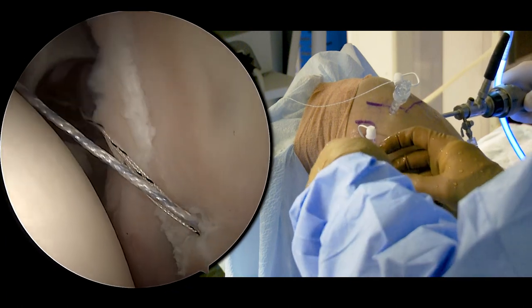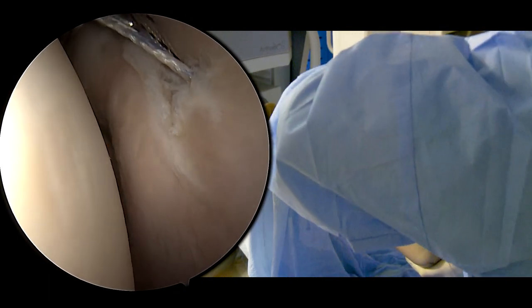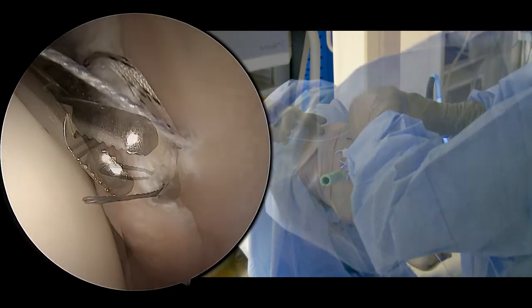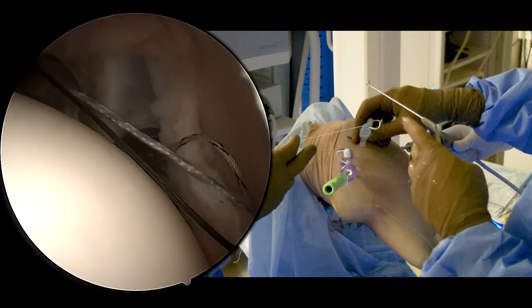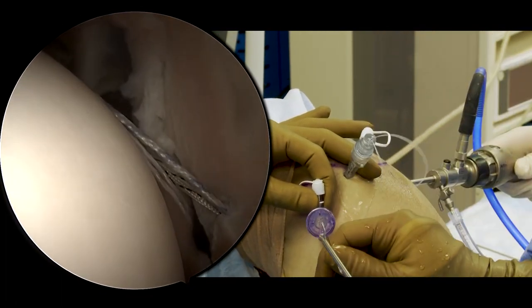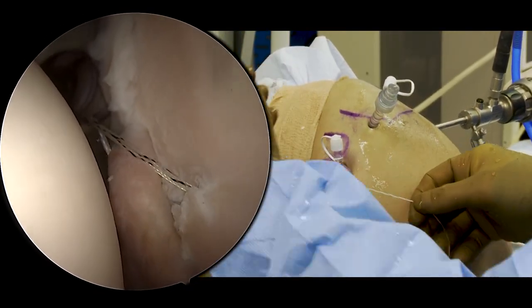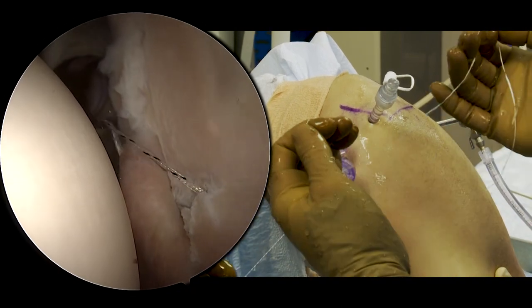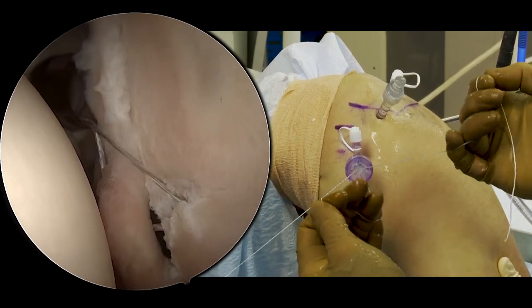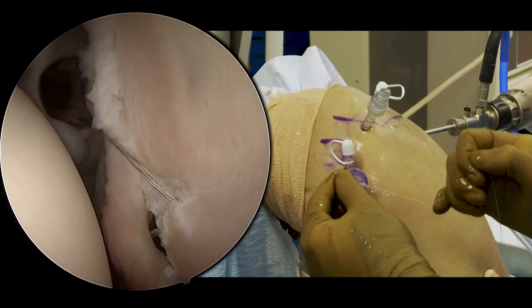We'll use a shuttling device here — a lasso that I can pull up on the tissue a little bit, come around the labrum, and then feed the wire through out the superior cannula. So then we'll shuttle this through. There's a loop on one end and a tape end — the loop end is the one we're going to want to use.